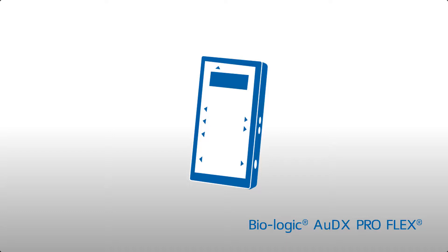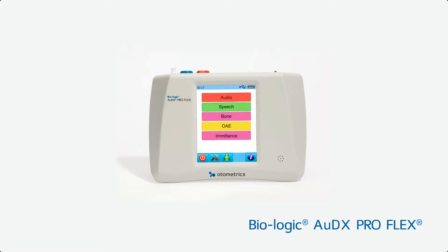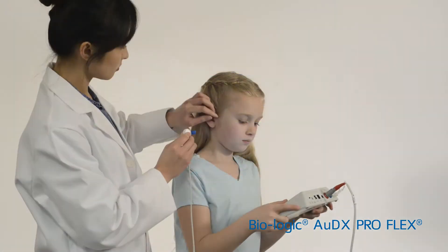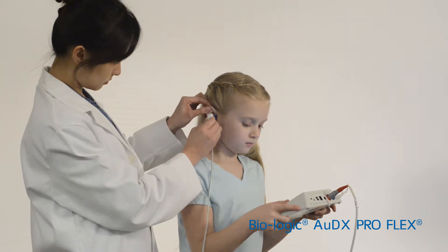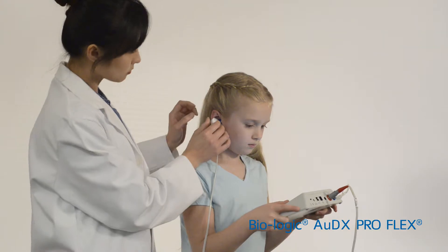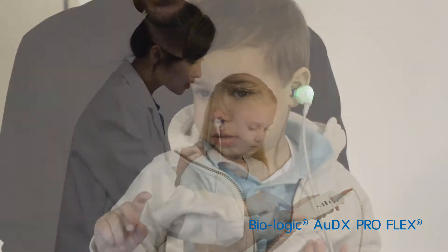The next-generation Bio-logic AuDX PRO FLEX is a flexible tabletop device from Otometrics, offering screening or diagnostic acoustic immittance. Diagnostic test features include multi-frequency probe tones, eustachian tube function testing for both non-intact and intact tympanic membranes, as well as the ability to do pressurized otoacoustic emissions.